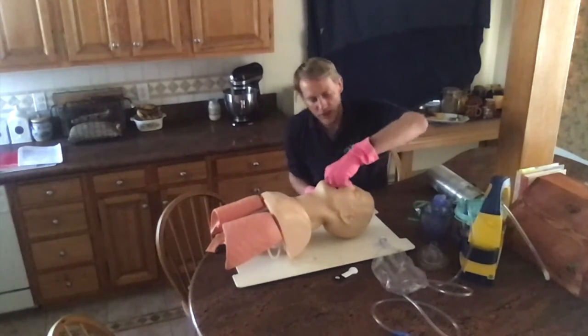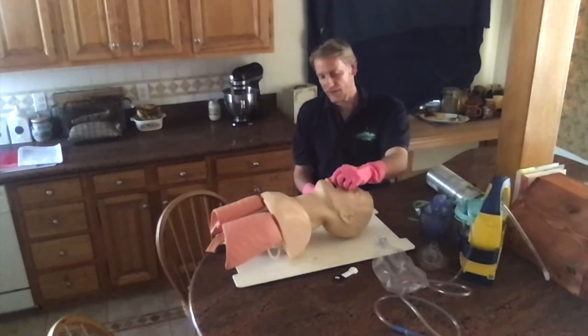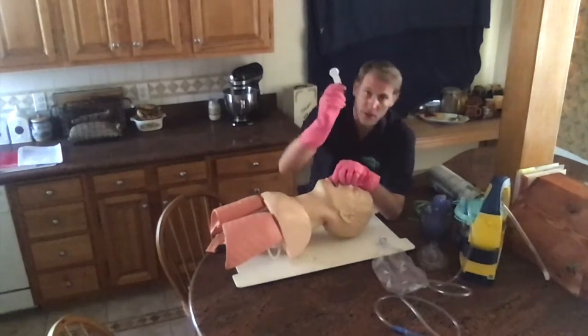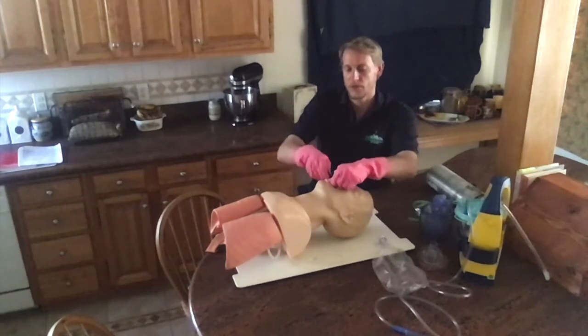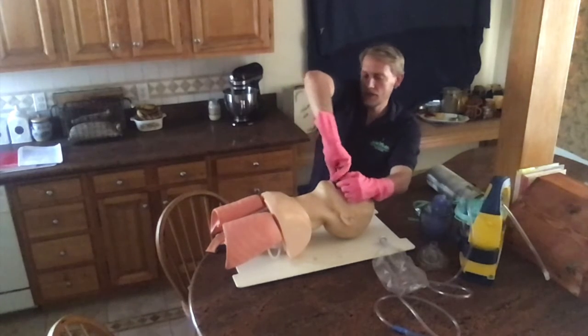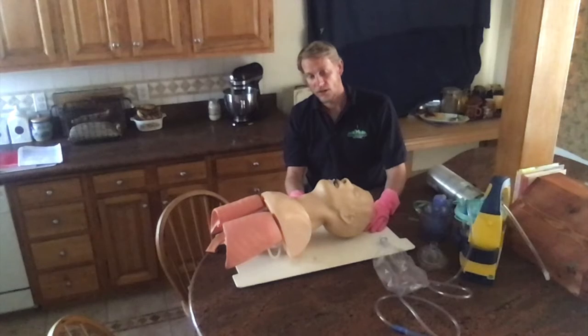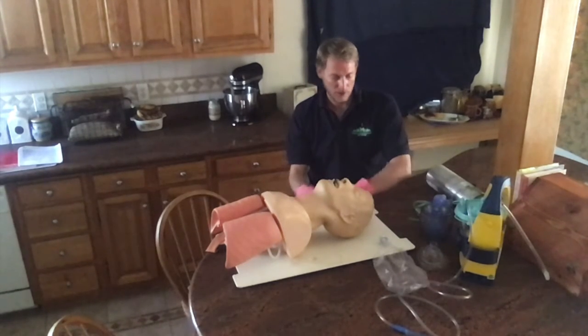I'll recheck the patient's airway. It appears the mouth and oropharynx are clear. I'll take my OPA, insert it into the patient's mouth at 180 degrees, and sweep the tongue aside. The patient accepts the adjunct and the airway is open.